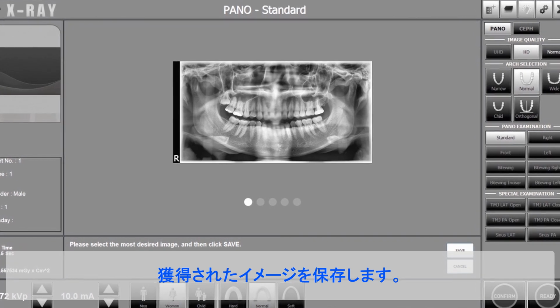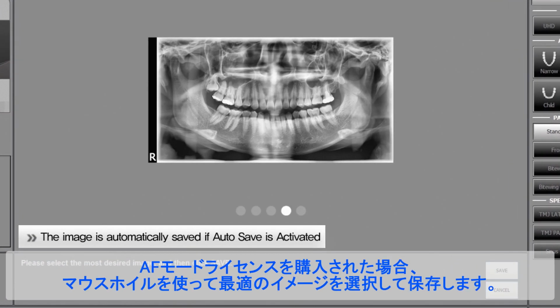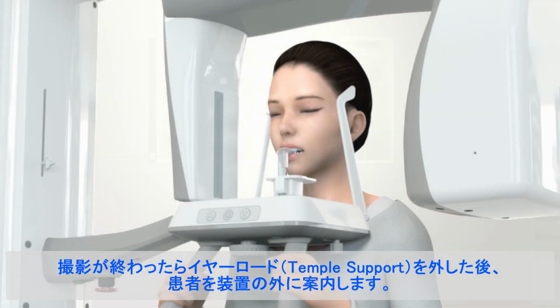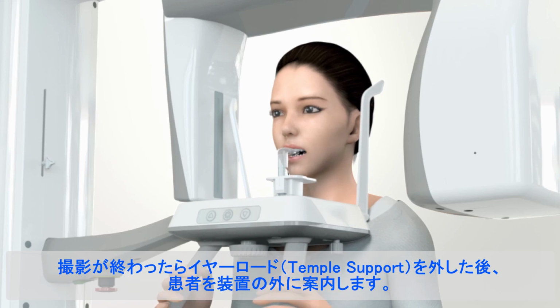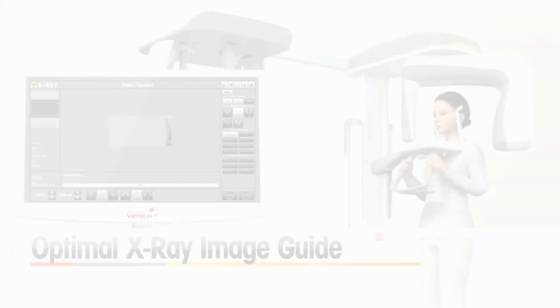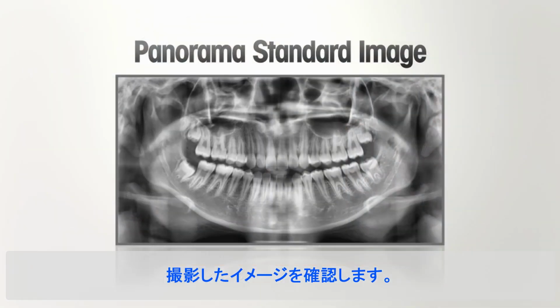After the image acquisition, save the captured image. If you purchased license of AF mode, select and save the optimal image using mouse wheel. If the manual save is set, click the Save button to save the image. After the image capturing, unfasten the temple support. Then guide the patient out of the unit. Check the captured image.